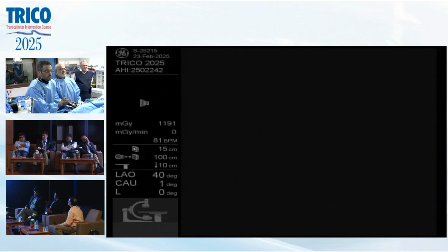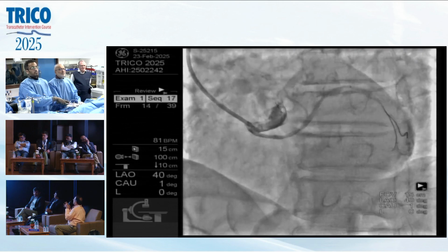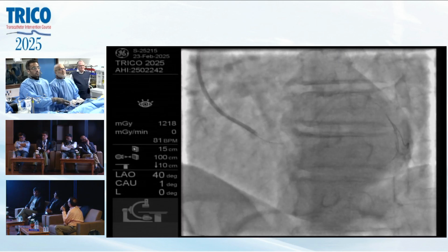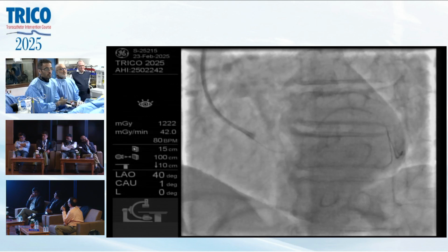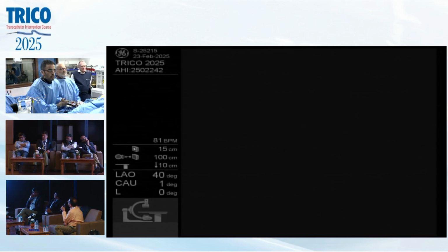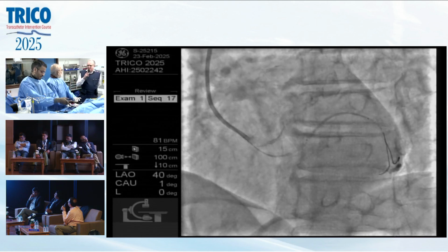Inject. Little more. Just a little. Little more, yeah. 2 or 3 millimeters more would be adequate. I think we are there now. Okay. Now you definitely are there. Let us check it. Inject. Now you're there for sure. Yeah, this looks good. Perfect. Yes. Can I go up?